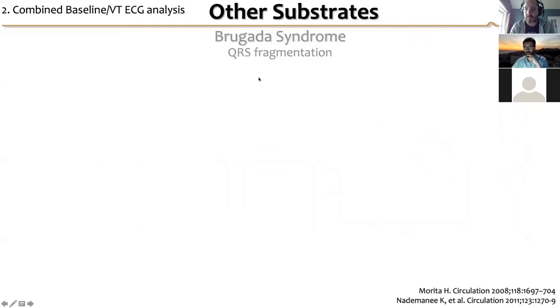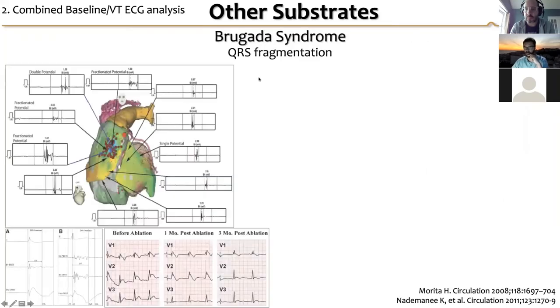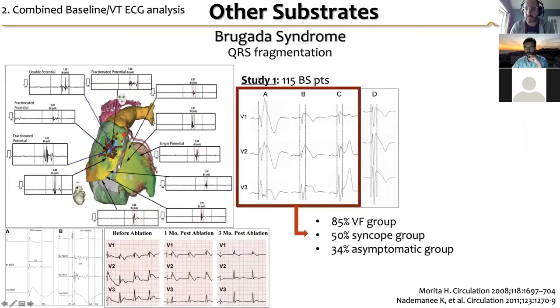And finally, in terms of Brugada syndrome, I will just go very fast over this, because the take-home message in Brugada syndrome is, if you get funny patterns of Brugada, you have to be aware that this patient is probably more arrhythmogenic as compared to patients with a more classical type 1 Brugada pattern. So be aware of that.